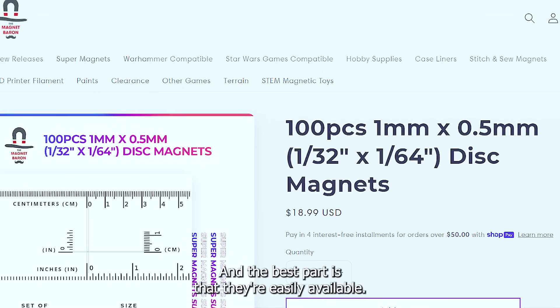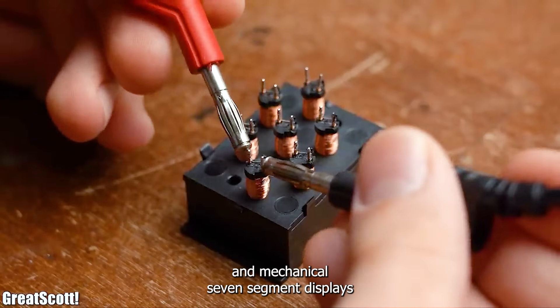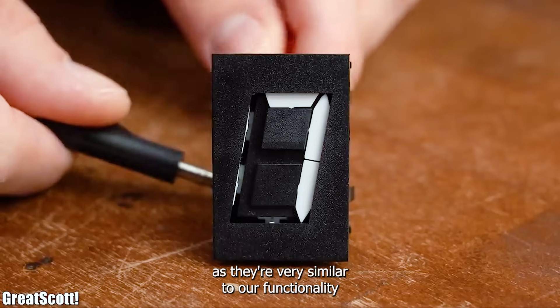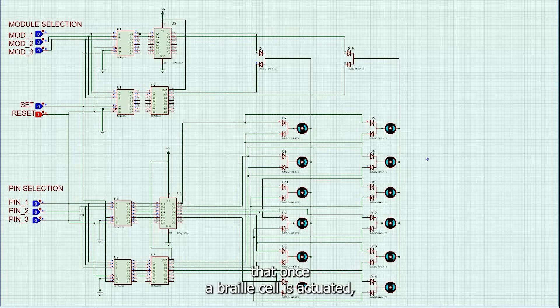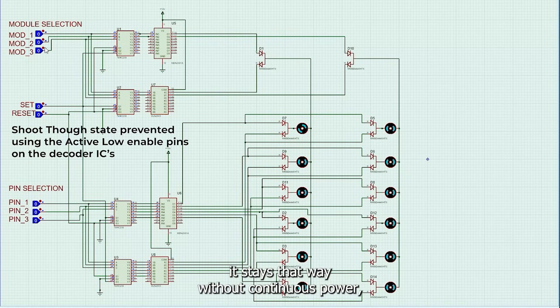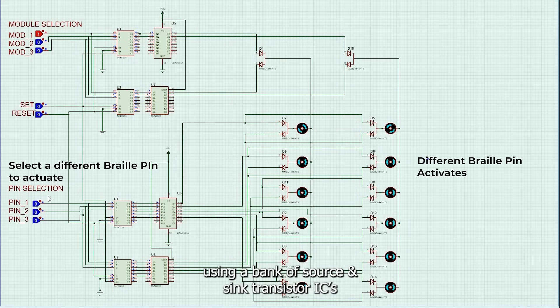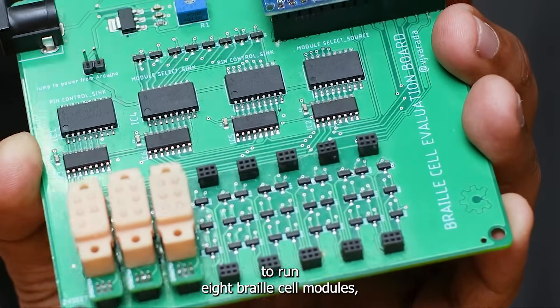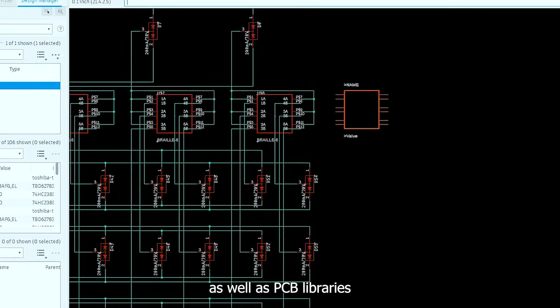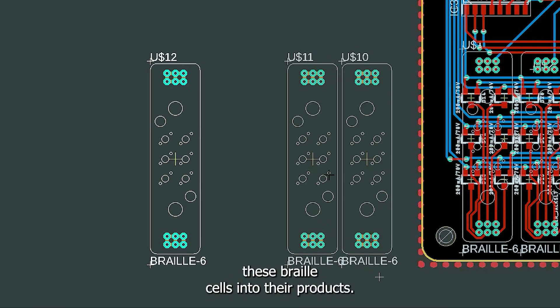On the electronics front, we have taken inspiration from flip-dot displays and mechanical 7-segment displays as they are very similar to our functionality. With a multiplexer system and taking advantage of the fact that once a braille pin is actuated it stays that way without continuous power, only a few microcontroller pins are needed to drive a whole array of cells using a bank of source and sink transistor ICs connected to a decoder IC. We have released a driver board schematic to run 8 braille cell modules, as well as PCB libraries and device libraries for designers to integrate these braille cells into their products.